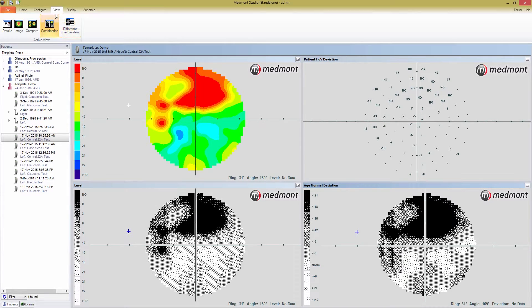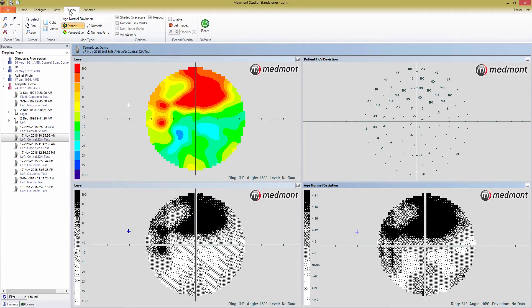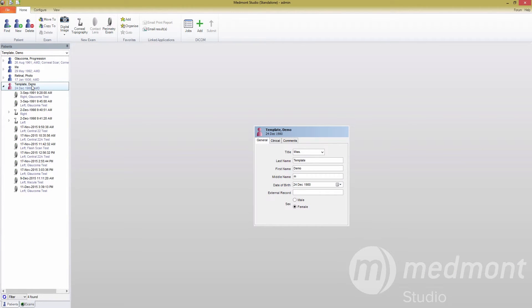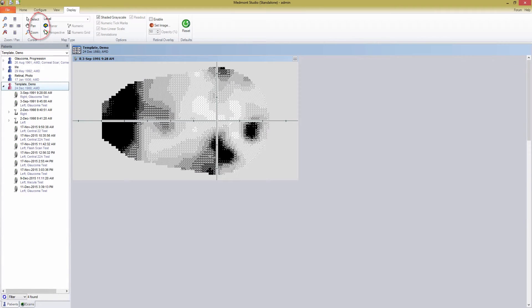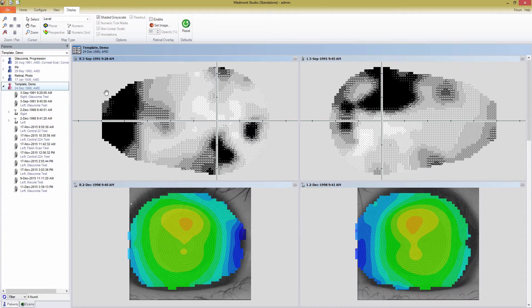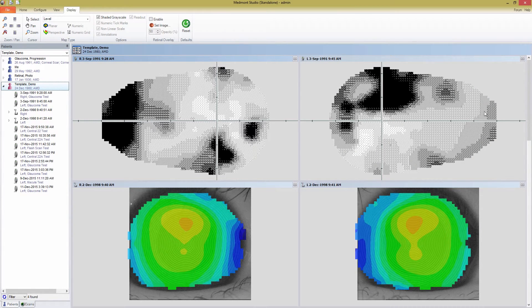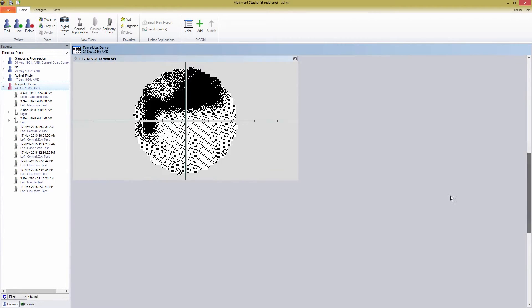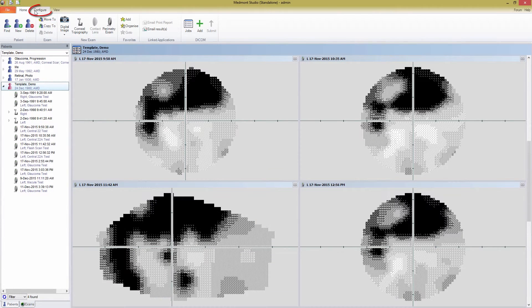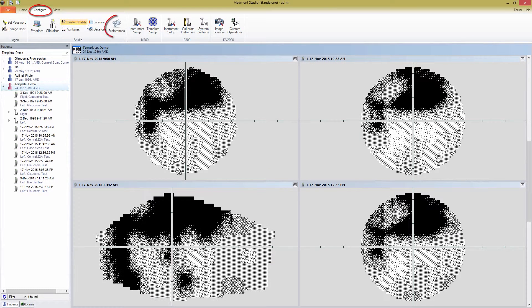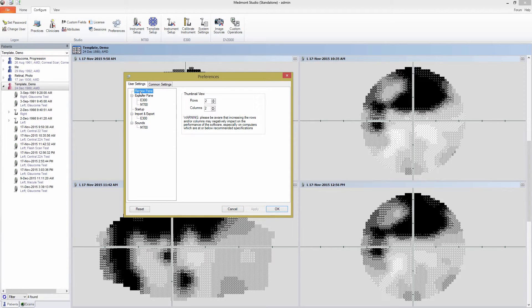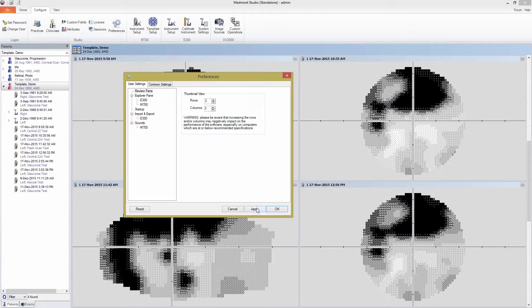The second extra display method is useful for viewing a patient's exam history. If you select a patient by name and return to the view tab, you'll find the thumbnail view. Selecting this displays every exam associated with that patient. The display options can be changed, but will apply to every exam of that type. You can also change the number of exams displayed by going to the configure tab and pressing preferences. Under the user settings tab of the preferences panel is the review pane, which you can select to change the number of images displayed per row and per column in the thumbnail view.